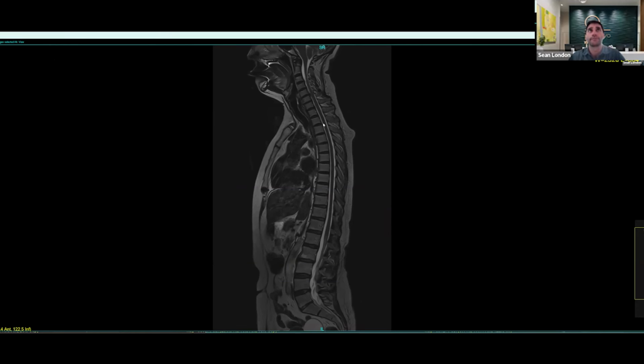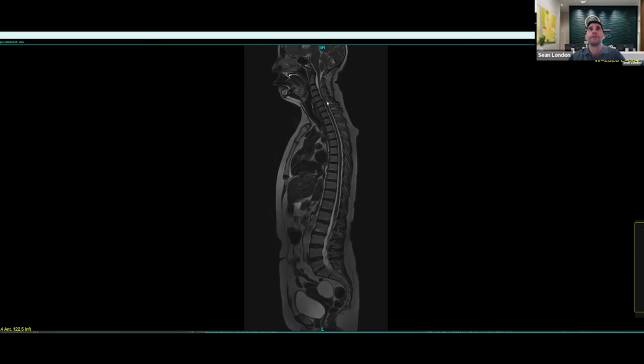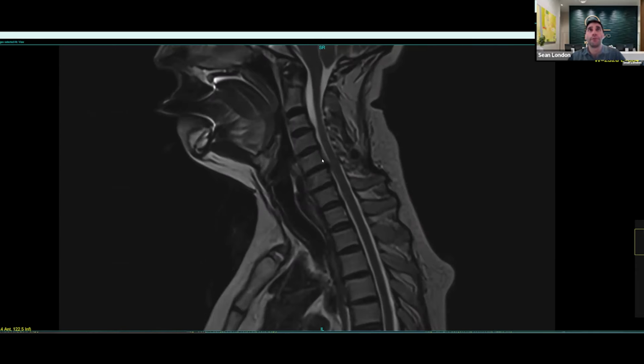These are the cushions. And generally what happens with the degenerative process, and just normal wear and tear through our lives, is we get pressure on these discs. And with that pressure, we start to get bulging of the disc backwards. So we can see a little bit of a bulge at this level. 5-6 is a very common level, and you can see that it's pushing backwards. This white stuff right here is the fluid that bathes the spinal cord, which is right here. And so we can see that the disc bulge is actually pushing on the fluid, but I don't see it pushing on the cord, which is good.